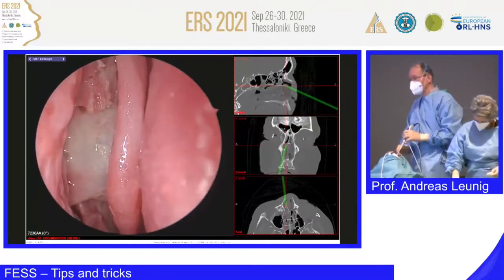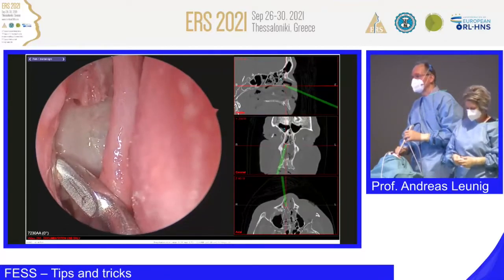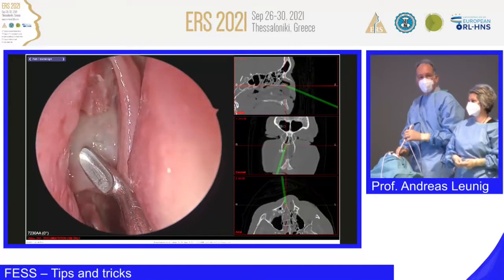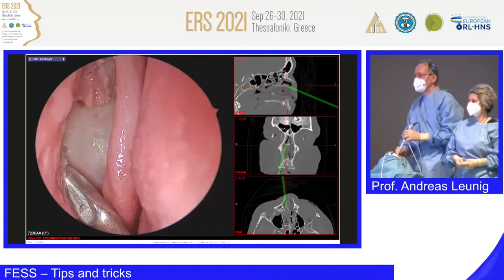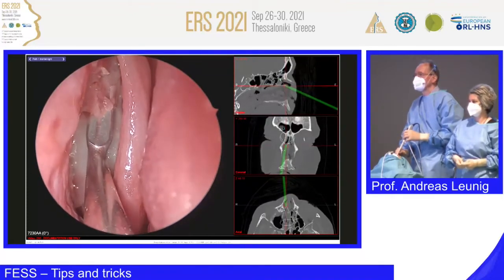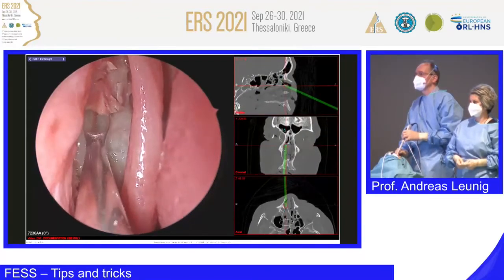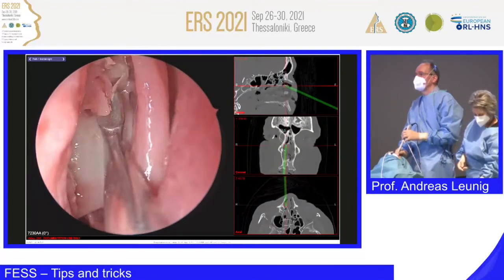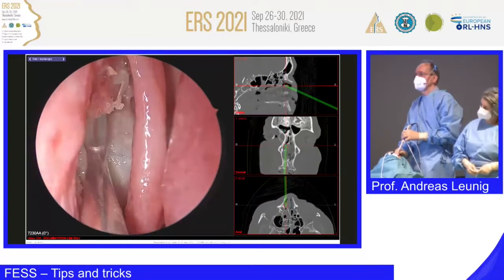We are going in, and now we still have the attachment of the uncinate process here in place. That's the first basal lamella, and this is helpful for navigation by anatomy. Now, the next step could be we can look a little bit up here, but this is the frontal recess area and we want to do it a little bit later. Maybe we clean this up a little bit here. We're taking these bony lamellas away. The giraffe, please.